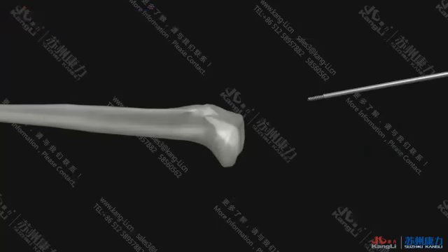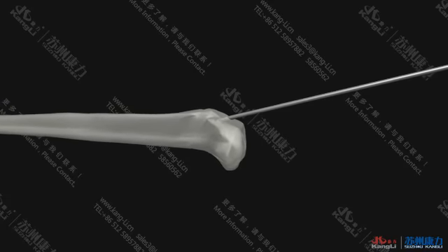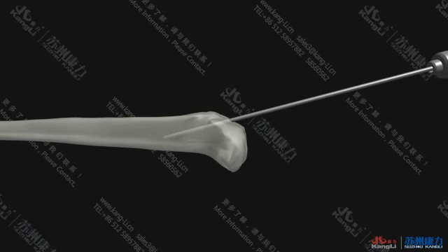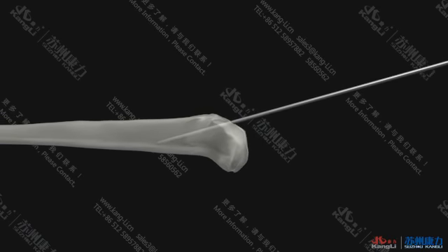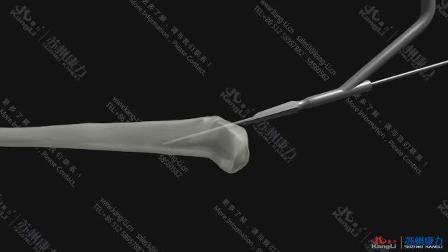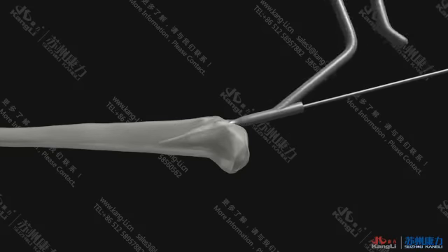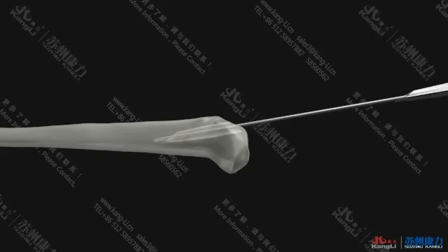Drill in the 3.2 gauge pin from the nail entrance point and monitor the placement with the fluoroscopy. With right placement, insert the countersink awl into the 3.2 gauge pin. Gently push and rotate to open the tibial bone marrow cavity by about 8 to 10 centimeters. Remove the 3.2 guide pin and countersink awl. Insert the guide pin introducer right through the fracture end under the monitor of fluoroscopy and by manipulative reduction.